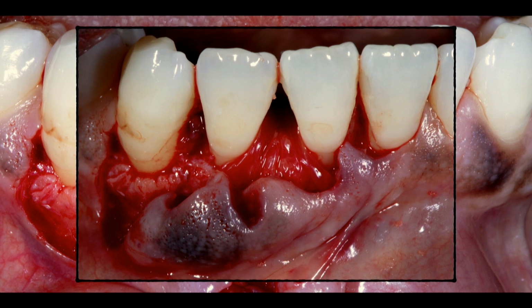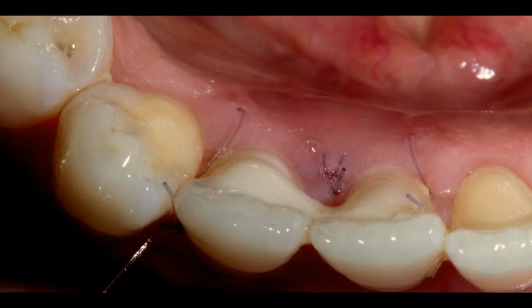Me and John talk about this a lot. A lot of times we will take trimmings of the membrane, this is off-label, and mix it with our bone graft because we're adding growth factors. But it doesn't technically need to be trimmed. And so we can have this sitting against the root surfaces of the teeth. This could not adapt any better, and get some nice closure.